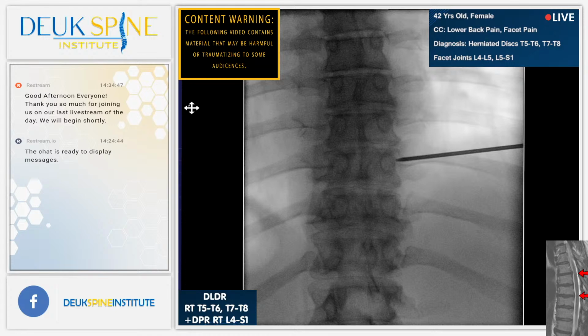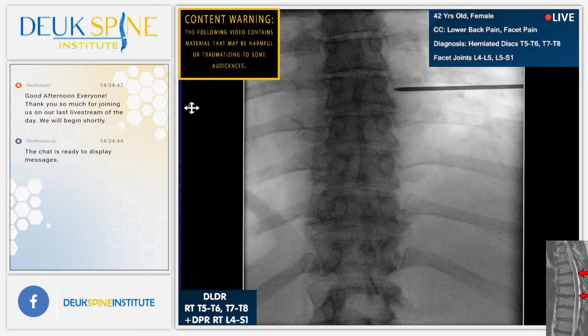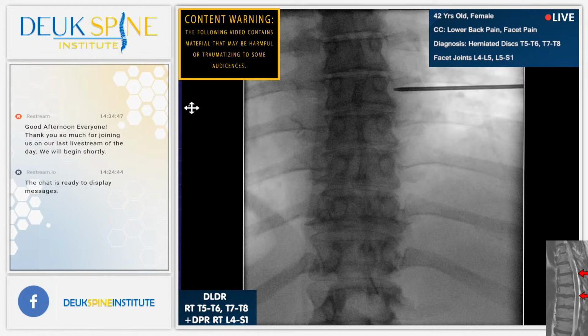And we need to make our way up to 7, 8. Nine, 8. Go ahead. That should be 8 right there. So 12, 11, 10, 9, 8. We're doing 7, 8. So we're doing this disc right there, right above that. Maybe you can bring the base a little bit closer so I could see a little bit better. Yes, sir. A little bit, no, that's good, but a little bit to you. Yep, perfect, that's good. All right, so our first disc is right there, 7, 8.